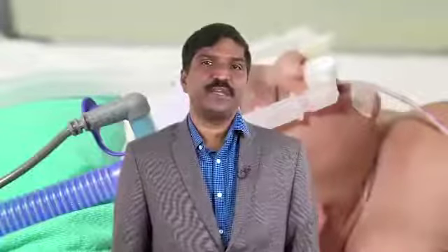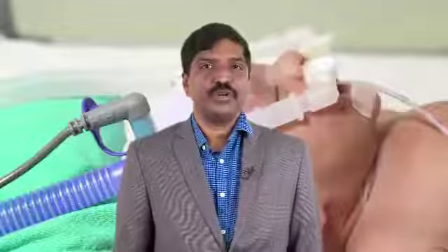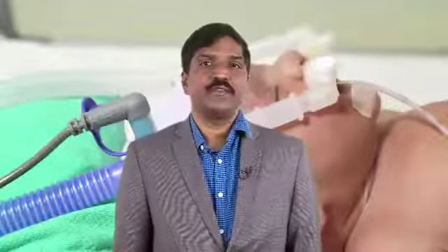As the length of the heating element is restricted in the inspiratory limb up to a few centimeters away from the nares of the baby, there is a drop in gas temperature from 39 to approximately 37 degrees Celsius in the inspiratory limb just before reaching the nares of the newborn. To ensure this estimated drop of gas temperature in the inspiratory limb, the last segment of the inspiratory limb should be inside the radiant warmer.